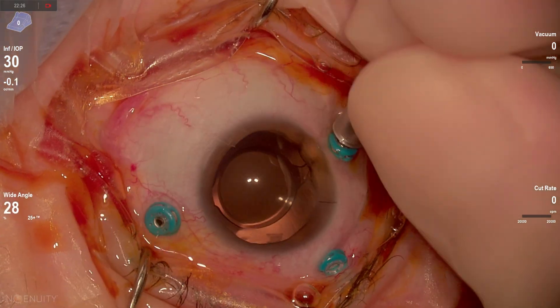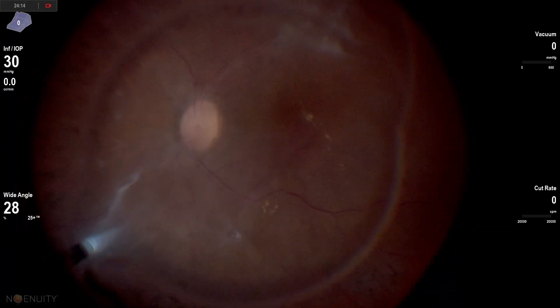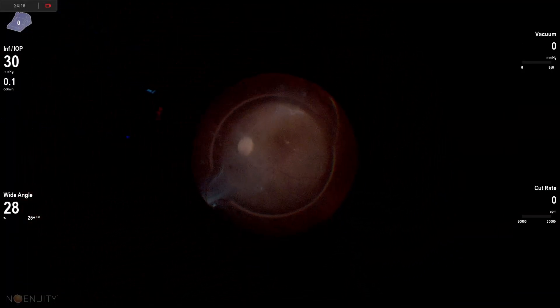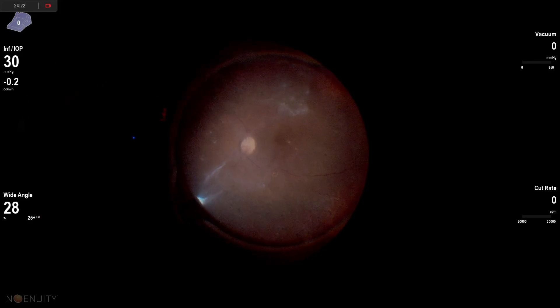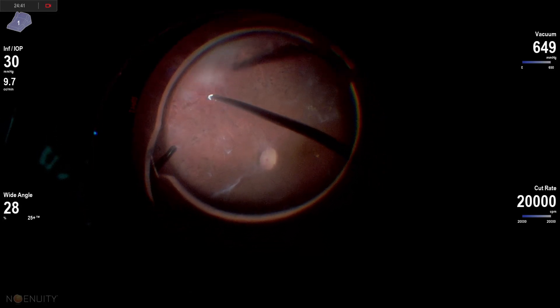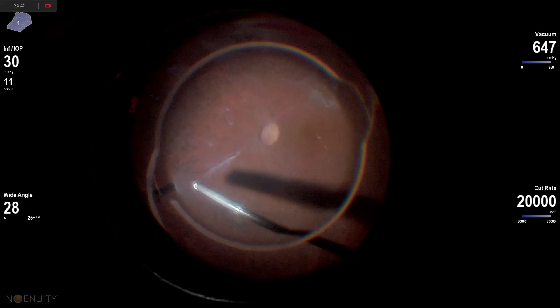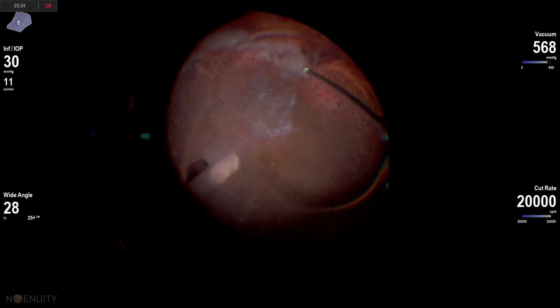Sometimes it's better to show a little bit of a longer case, and this is a tough diabetic patient who has a lot of mid-peripheral traction. I think it's good to just go through how these cases can be difficult, even for someone who's been in the retina space doing surgery for quite a while and enjoys tackling tough situations. This patient really tested that.